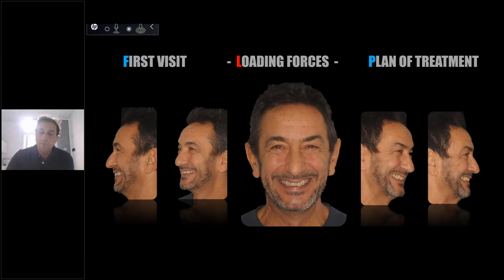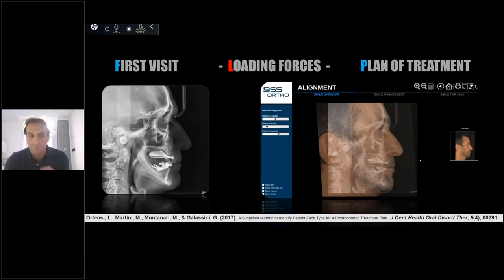in this position. For example, this patient is a male, for me a young male, because I have old patients, because I am a prosthetic dentist, so I work on old patients. But this patient, I don't know if he is a very strong patient or a low force patient. For me, it is not so easy to know this data. So I check the patient's face. I visit the patient. I can understand if, for example, it is a brachyfacial patient or square face or long face, but in the first visit, I control the face of the patient.